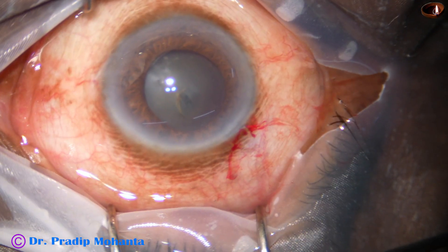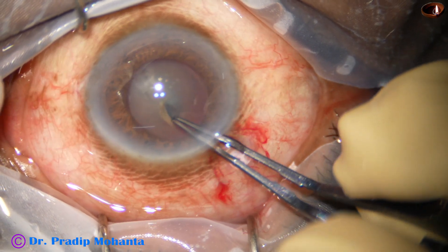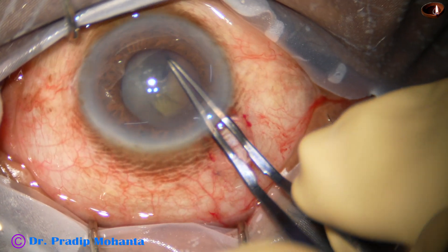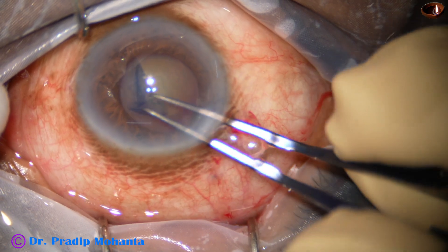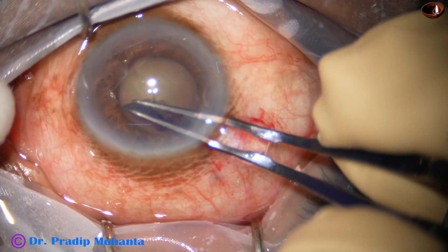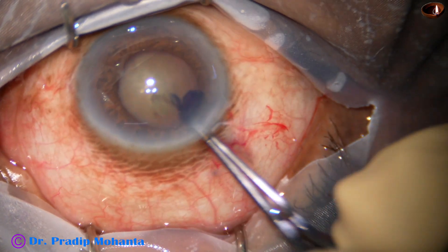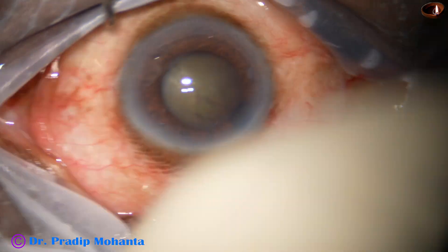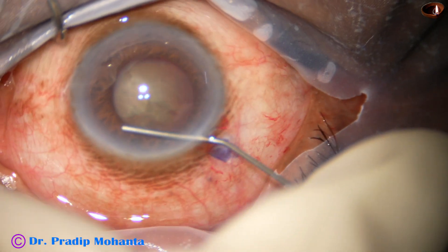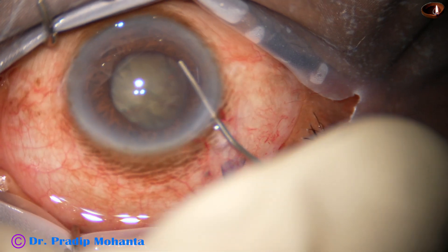I used a sharp needle to raise a capsular tag. Now I hold this capsular tag with the utrata forceps and very gently, taking a lot of time, I am doing this rhexis. I have kept a pupil expansion device ready and if I need it at any point, I will use it. I have got a rhexis of about 4.75 millimetre size and this should be okay.